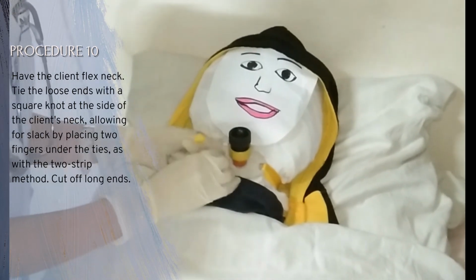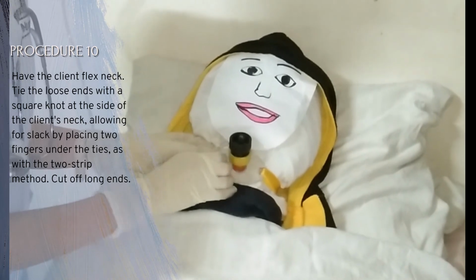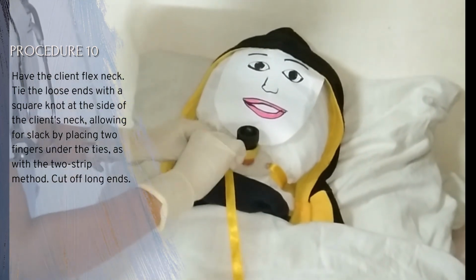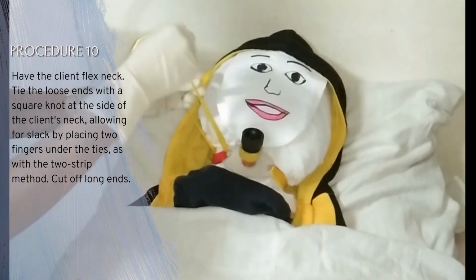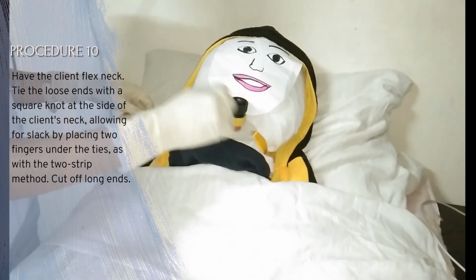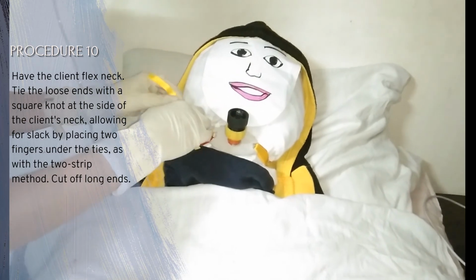Have the client flex the neck. Tie the loose ends with a square knot at the side of the client's neck, allowing for slack by placing 2 fingers under the ties, as with the two-strip method. Cut off long ends. Flexing the neck increases its circumference the way coughing does. Ties must be taut enough to prevent accidental dislodging of the tracheostomy tube, but loose enough not to cause choking or pressure on the jugular veins. Ties at the side of the neck are more comfortable for the client.